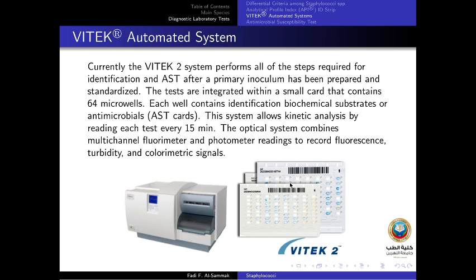If you still remember, when you grow microorganisms in a broth, one of the reasons is to measure the turbidity and know the amount of growth. So in order to make all the isolates equal, we have to set them to a certain level of turbidity before they are introduced into the device.